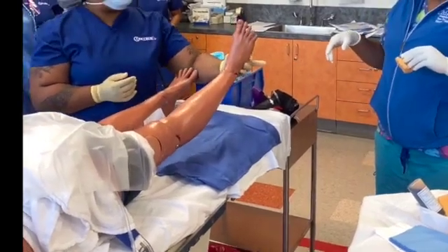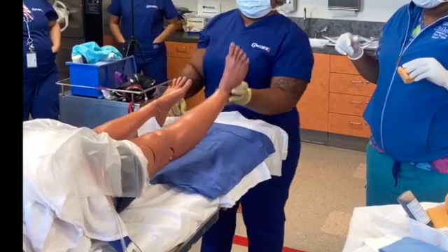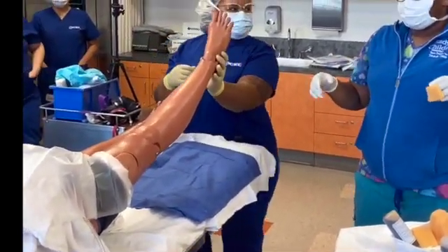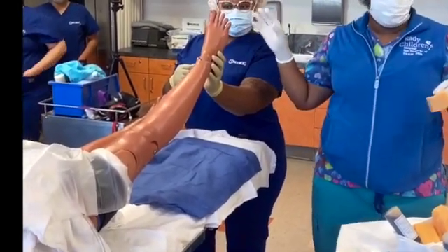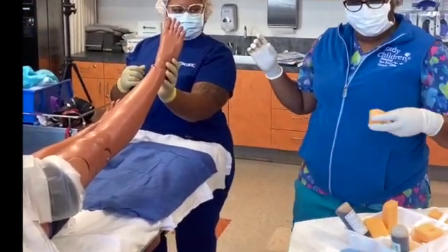So body mechanics. Body mechanics, yeah. Goes to the end of the table. So your hands are going to be wet and sticky too? Well, sterile gloves. Yeah. So the reason I'm doing this is because I'm going to take this from her. Okay, I'm going to take it from her. So I've already cleaned her, and I'm going to take it from her.